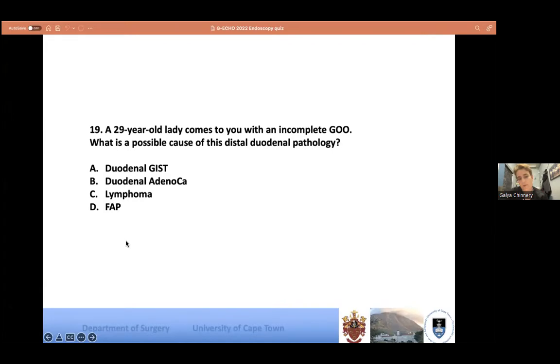Okay, let's see, Cheryl. Yeah, lymphoma. So I think I would very much be concerned as regards either adeno or lymphoma. I find it difficult sometimes endoscopically to differentiate, and sometimes you just really can't. It's just a guess. I did tell you she's quite young. Yes, you get adenos at any age, obviously, but lymphoma of the duodenum is a very scarce thing, and when we do see it, it's invariably a younger person, unfortunately. So, yeah. So that was lymphoma.